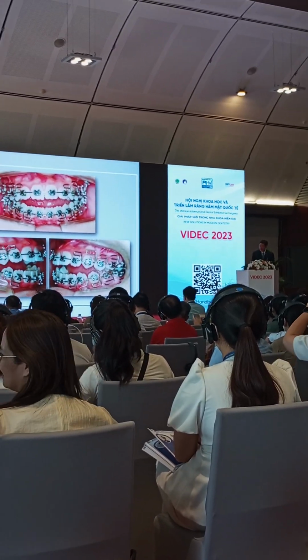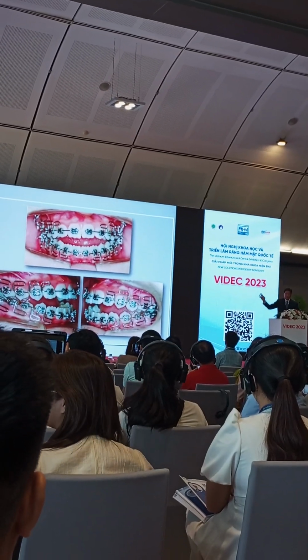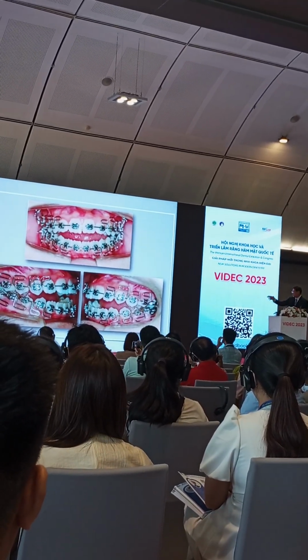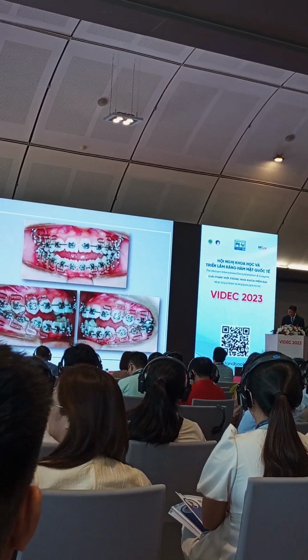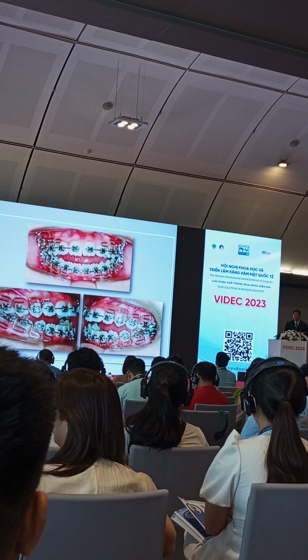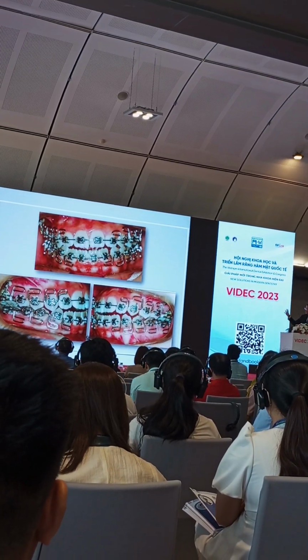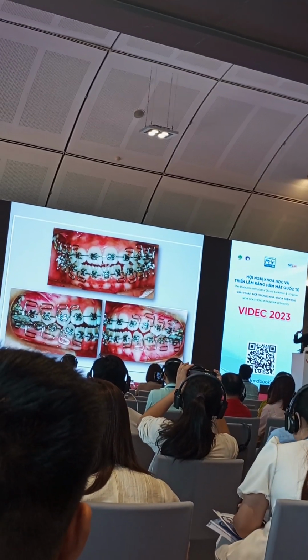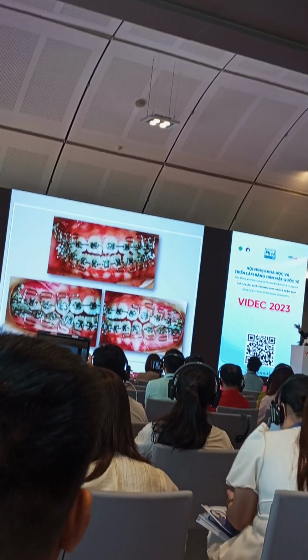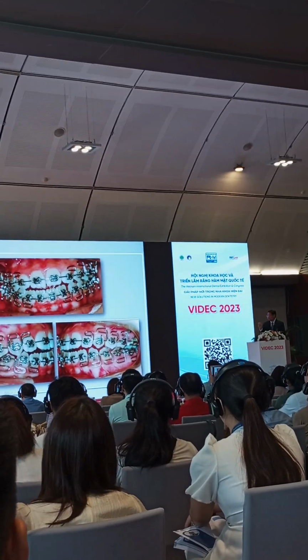If you try to look at the right side, you can see now my molar getting into a thick buccal overjet, because my molar is now starting to tip buccally because of the direction of the pull on the buccal segment. Patient came back, yeah, the bite closed, but I can see now my molar on the right side getting into a cross bite. But during this time, I was so happy, because the bite started to close.